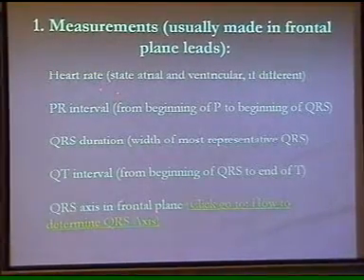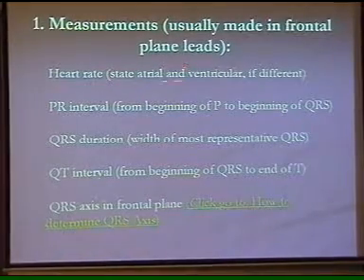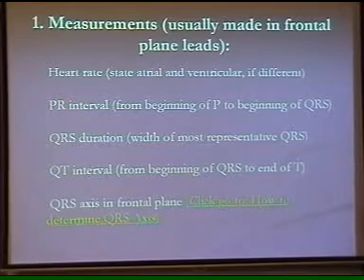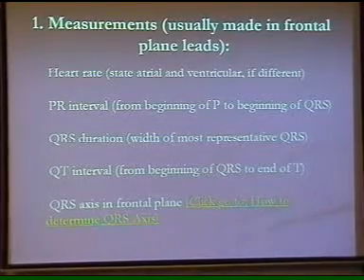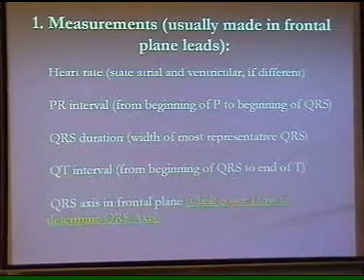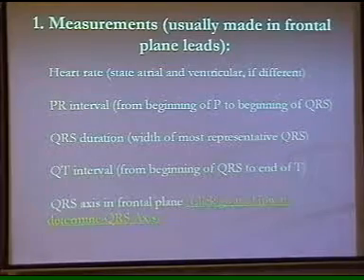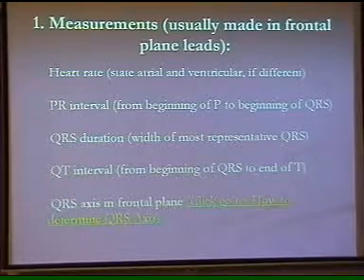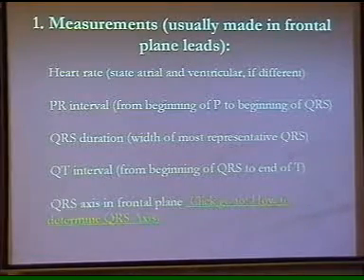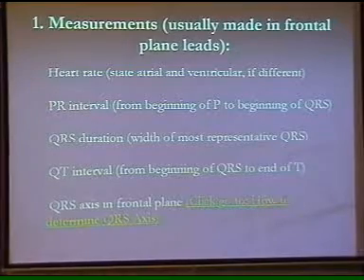So heart rate basically is, you can state the atrial heart rate and ventricular heart rate. In sinus rhythm they should be the same, because each ventricular beat is preceded by atrial contraction. But it may not be the case in AV dissociation. You need to remember only 2 cases of AV dissociation in which the atrial beat is not getting through and is not one-to-one with the QRS complex.